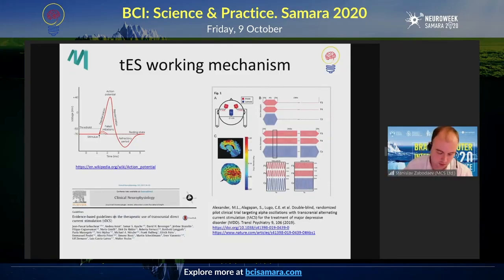In that sense, the resting state potential goes up for an entire group of neurons, and the adjacent neurons continue firing a specific neuron by action potential. And at the moment when the total transmembrane potential crosses a certain border, this neuron fires. You increase the excitement of certain groups of neurons in the area under this anode, or electrode connected to the positive pole.